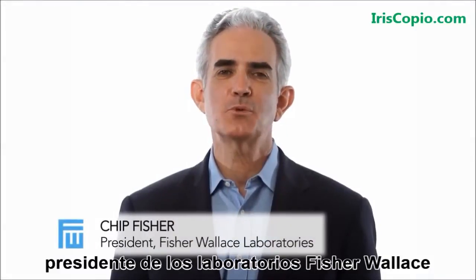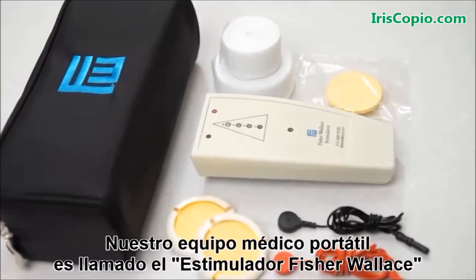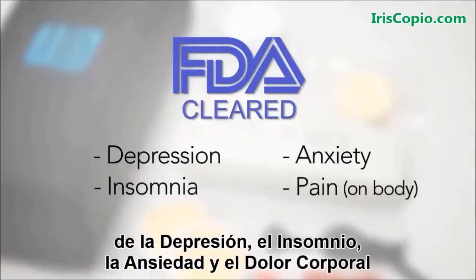Hi, I'm Chip Fisher, President of Fisher-Wallace Laboratories. Our portable medical device is called the Fisher-Wallace Stimulator and is cleared by the FDA for the treatment of depression, insomnia, anxiety, and pain.